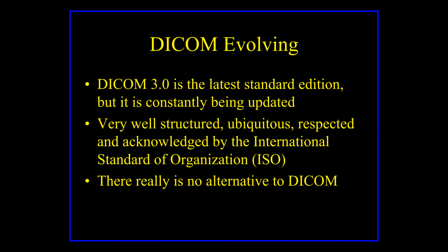The latest one is the DICOM 3 standards. There's actually a worldwide committee that regulates this, that changes it, that improves it, that gets rid of bugs. And it works all over the world. So the cool thing about DICOM is that I can sit here in Houston and I can take an image of a dog and I can send it to anybody in Iran, and as long as I have their computer information, they'll go through and the image quality is just like I'm seeing it here. There's no degradation. They can manipulate them.